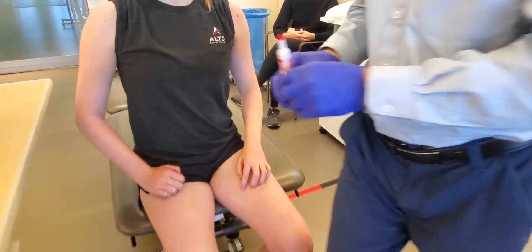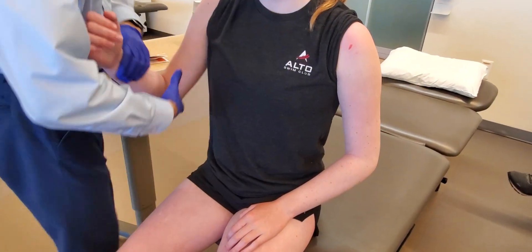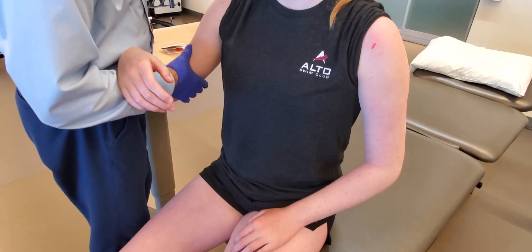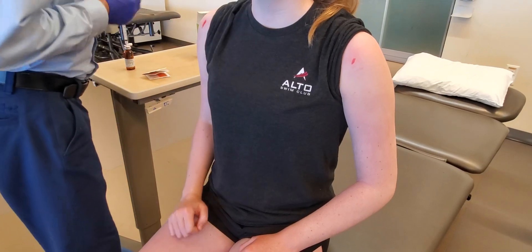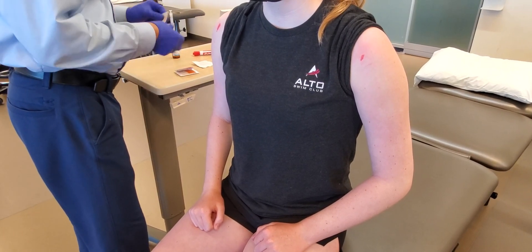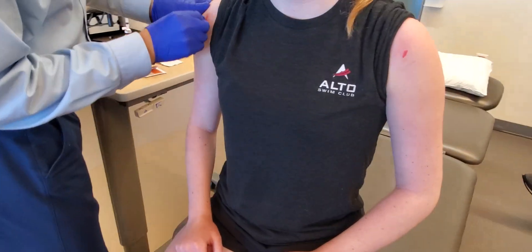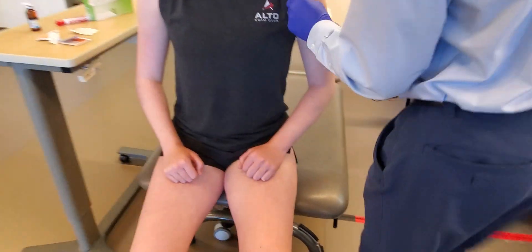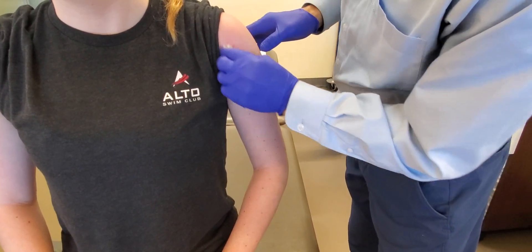So this is going to be our marker. We had a nice freckle from last time that helped guide us to this spot. We're going to prep the area. Sometimes it's better to rub it down with alcohol first because sometimes it will take off the marker, but we still have a guide there on the other side. You can still kind of see where we left the mark.